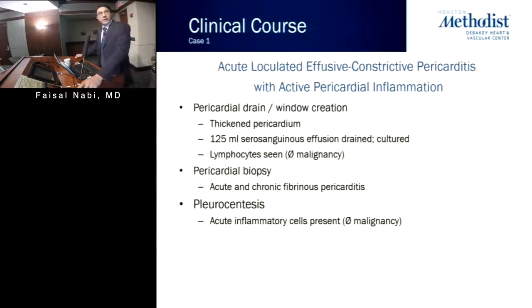As our distinguished colleagues rightfully mentioned, at this point the physicians made a clinical decision based on their physical findings, talking to the patient, and the imaging findings, that we're going to go ahead and obtain fluid on this patient. Because it was loculated anteriorly and laterally, this patient was sent for a surgical drain and pericardial biopsy.